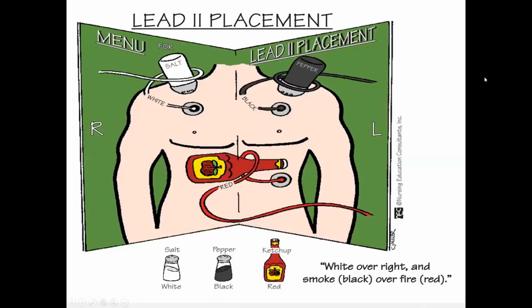So here is the placement of the electrodes. I always remember white on right, black on left, red heart. That's how I remember it. Some people like white over right and black smoke over red fire. I like white on right, black on left, red heart.